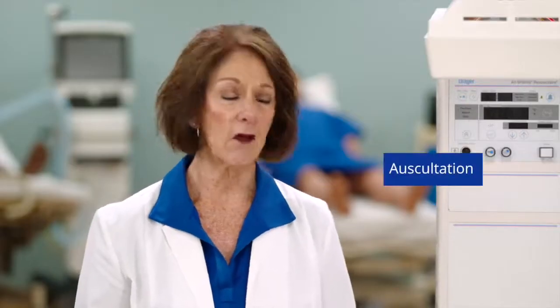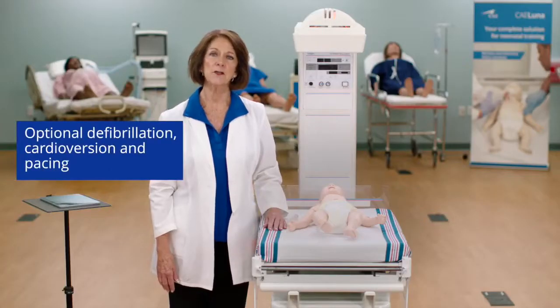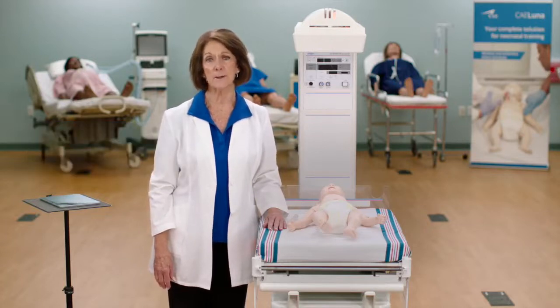Luna Live also includes needle decompression on the right side, chest tube placement on the right side, auscultation of heart, lung, and bowel sounds, and vocal sounds, as well as optional defibrillation, cardioversion, and pacing using live equipment.